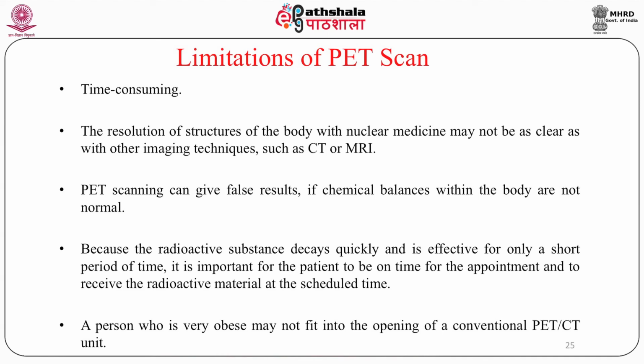A person who is very obese may not fit in the opening of a conventional PET CT unit, and this is very well true in case of other examinations also. If your patient is obese, he may not go into the gantry because of his weight and other reasons.